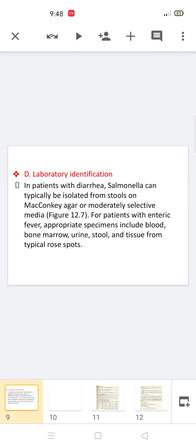In the first test, we have antibodies but we identify the antigen. In this test, we identify not just the antibodies but the titer of the antibodies, which means the amount of antibodies, by a known antigen found in commercially prepared kits in our hand.